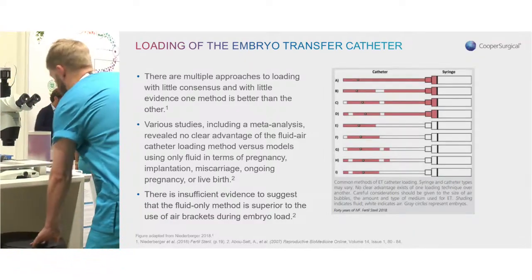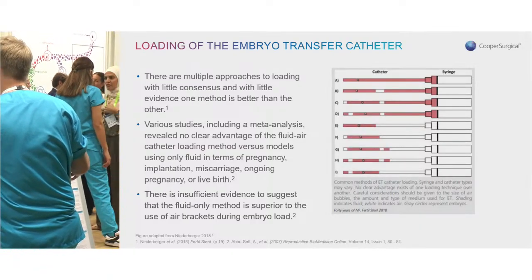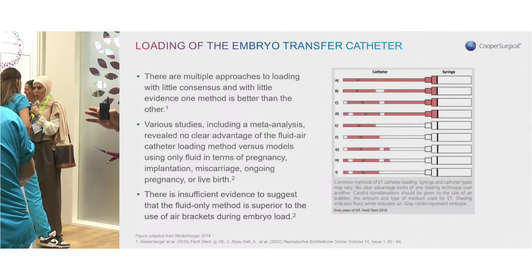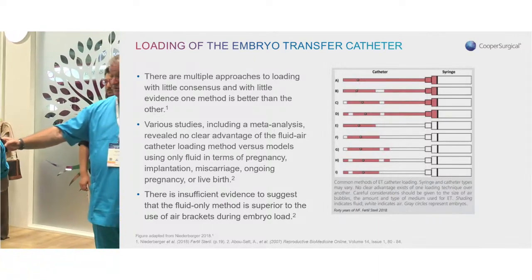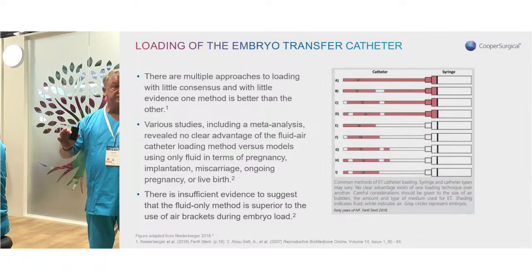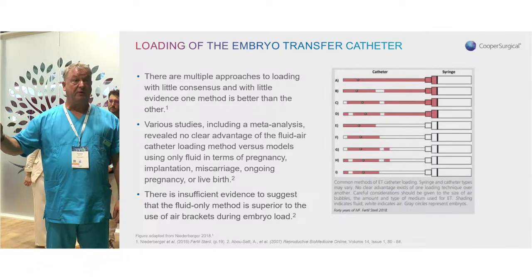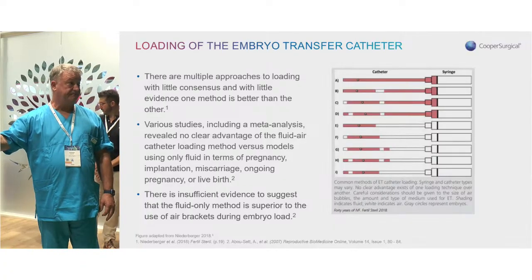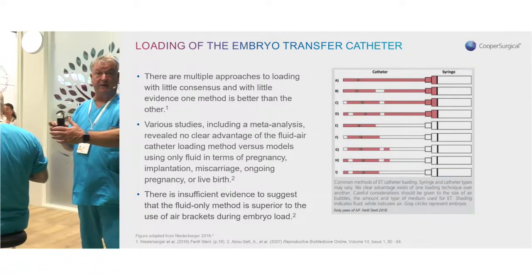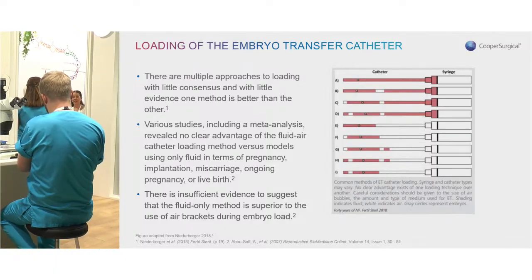Okay, so the key point there that Joaquin highlighted is, once this station has been locked, we cannot do anything else here than what we've designated we're going to do. And in this case, it's an embryo transfer. So when Anton brings the dish into the work area, the system automatically recognizes that dish with the right patient's embryos, and he has to confirm on the screen that he's doing an embryo transfer on that patient with that dish. So it's eliminating the chance that somebody else could come in and start doing something else when you're working, and we're only going to be able to do an embryo transfer for this particular patient.